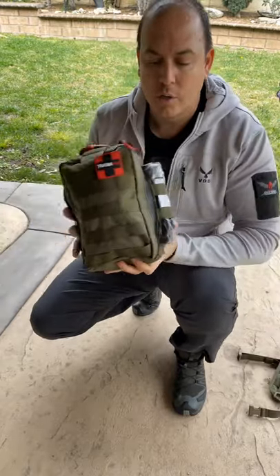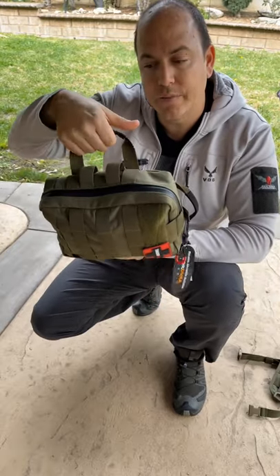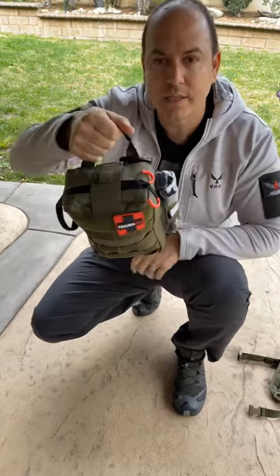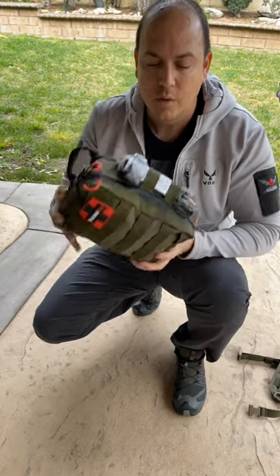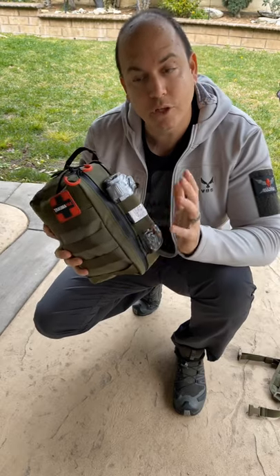We made sure there are two ways of carrying this: a larger handle for a gloved hand and a normal-size handle. On the outside we went with one of the standard tourniquets — this is a CAT tourniquet, and that one is meant for the human.